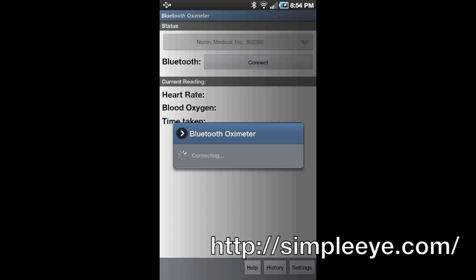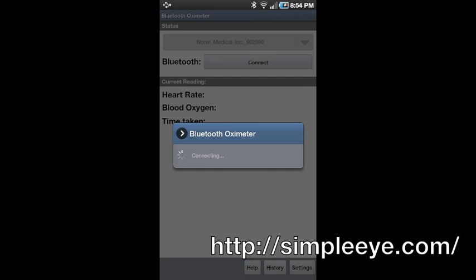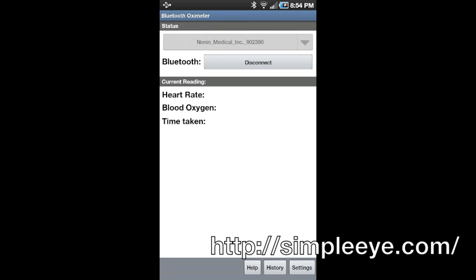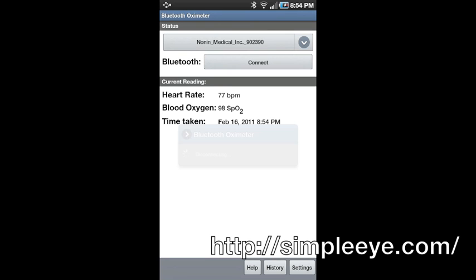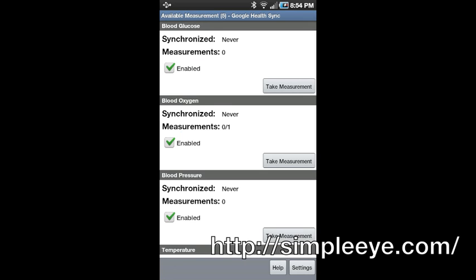Turn on your Bluetooth pulse oximeter to take the measurement. Once the measurement has been taken, tap the Back button to return to Simple Eye Google Health Sync. You will see that the number of measurements has been updated to include the new measurement you just recorded.